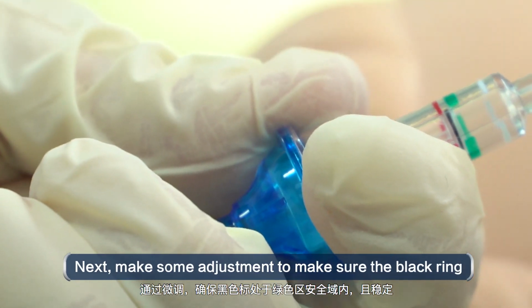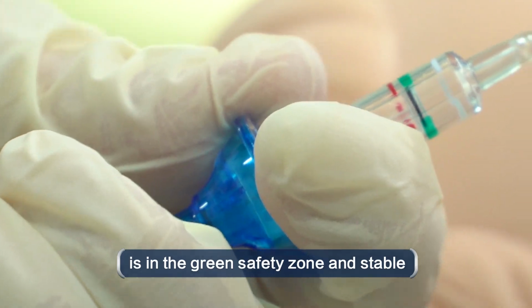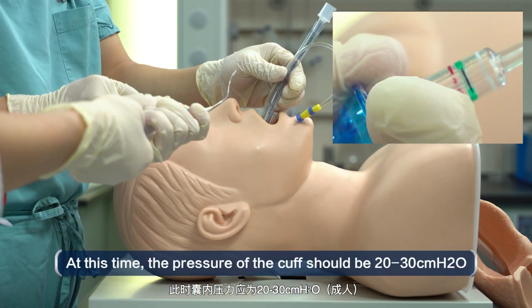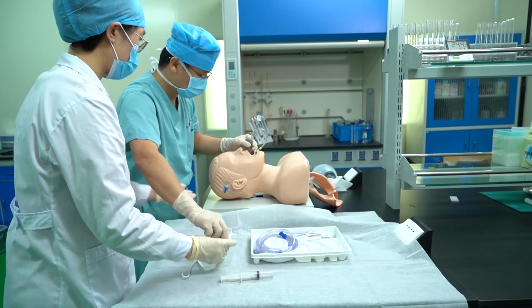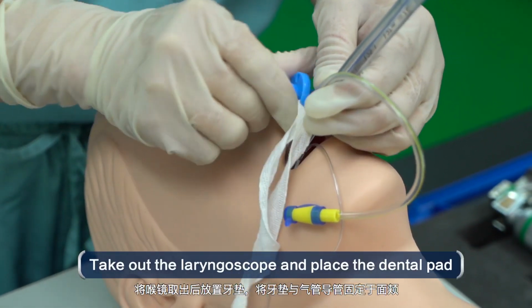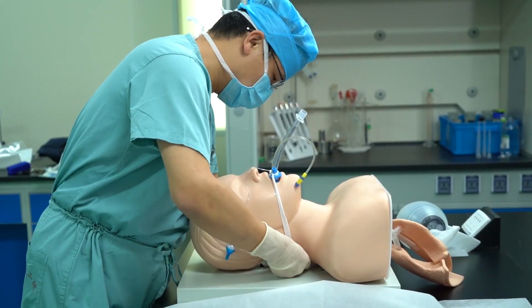Next, make some adjustment to make sure the black ring is in the green safety zone and stable. At this time, the pressure of the cuff should be 20 to 30 centimeters water pressure. Then rotate and pull out the syringe. Fix the endotracheal tube. Take out the laryngoscope and place the dental pad, then fix the dental pad and the endotracheal tube on the cheek.